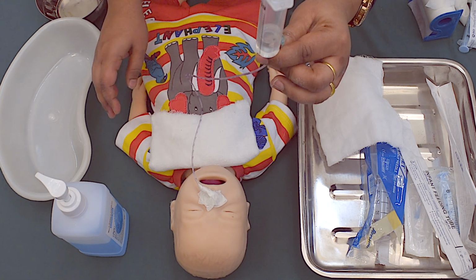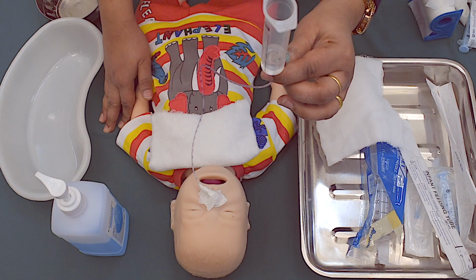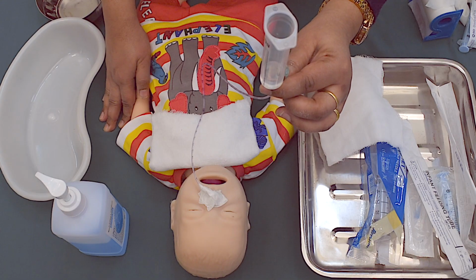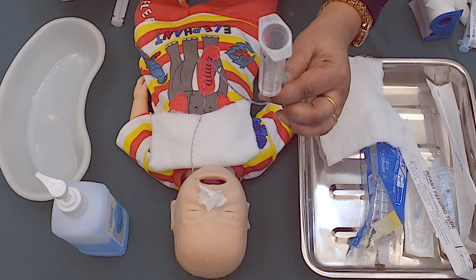Once the required amount of feed is given, flush the tube with a little amount of drinking water. It can be like 2 to 5 ml. This will prevent blockage of the tube.